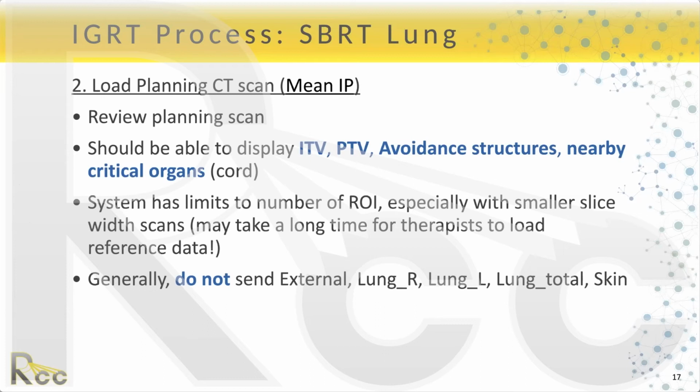Yes, Ben, what I understand is that we will just deliver the area of interest, let's say, not the whole contouring or the whole reference image that we taken during the simulation. Am I right? So the entire mean IP data set will be sent over. So that will be there.